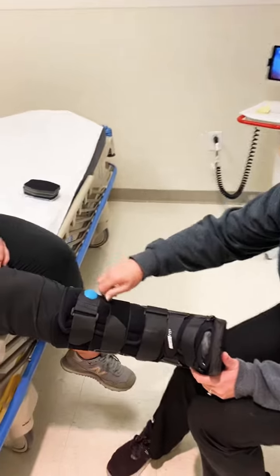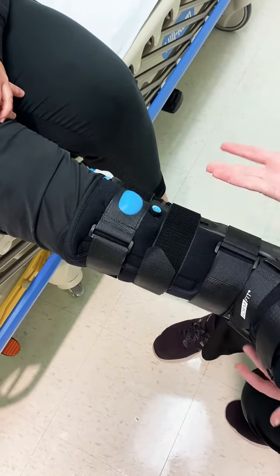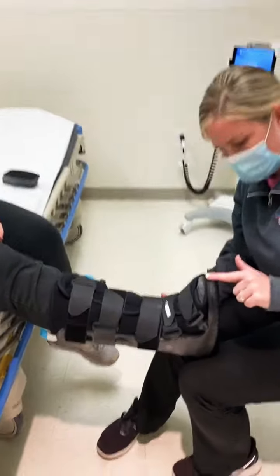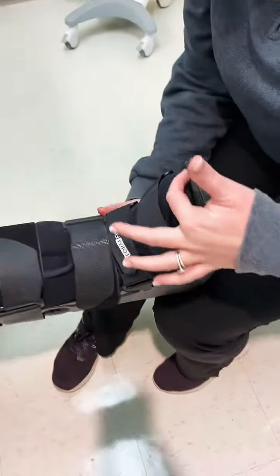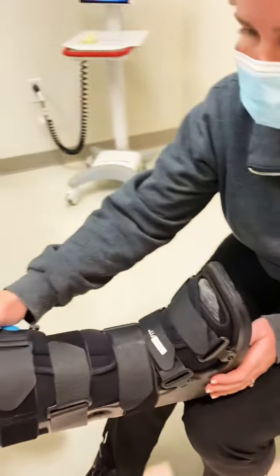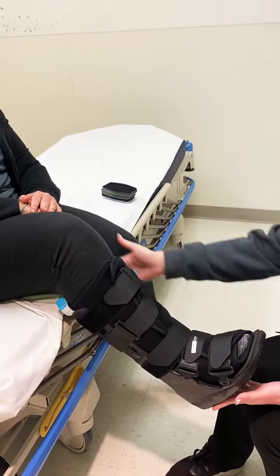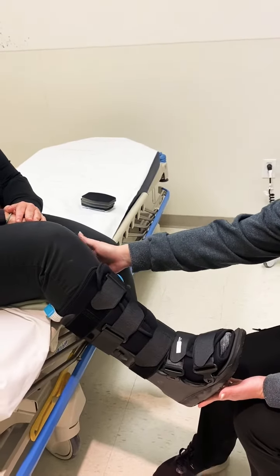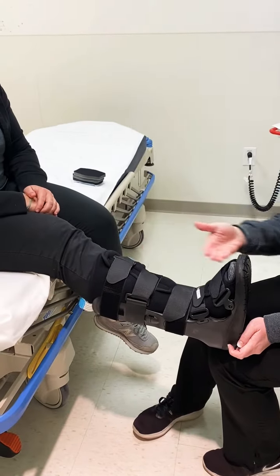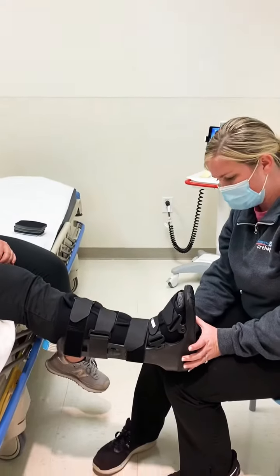If you don't want air, turn it all the way to the left to the deflate setting and it'll let the air out. When sizing, make sure the toes aren't hanging over the edge — if they're right at the edge that's okay, but they shouldn't go past that front piece. Also check for comfort at the knee; you don't want the boot going too high up. If it is too high, you can sometimes trim it, but usually the shoe size will coincide with the boot size and you won't have to worry about that. And that's it.